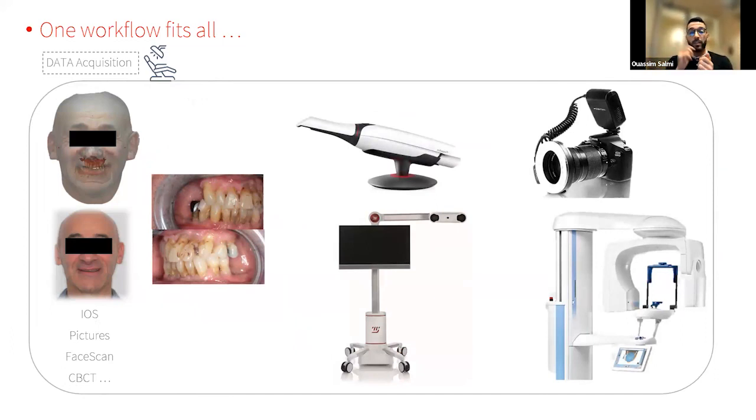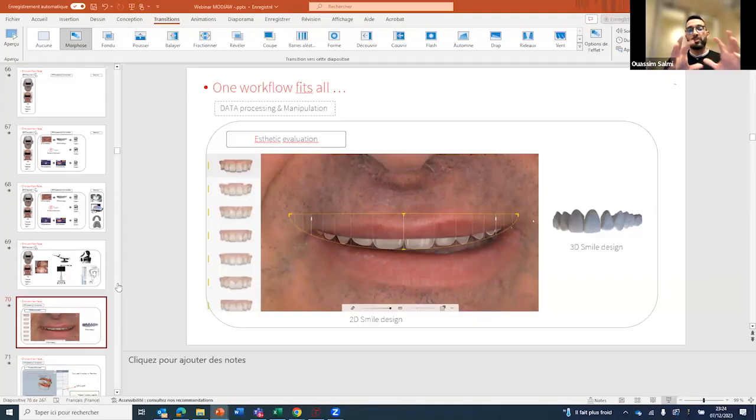Intraoral scanners, and then CTs, and then pictures, face scans if you want, and then Modjaw, so to have a complete dynamic set of data. And then if you go to the next step, which is the data processing manipulation, how to work with the dynamic patient. What I want to share in here in the data processing is that it can be like aesthetic evaluation here.